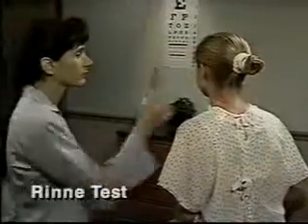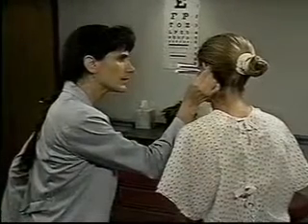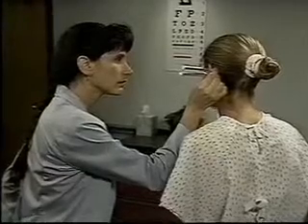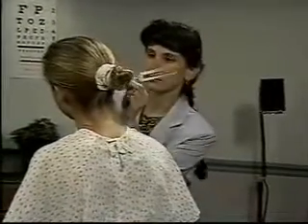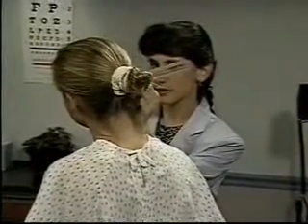To do the Rinne test, place a lightly vibrating tuning fork on the mastoid bone behind the ear. When the patient indicates that the sound is no longer heard, quickly place the vibrating fork close to the ear canal. Normally, the patient can hear vibration longer through air than through bone. Can you hear this? Repeat the test on the other ear. Tell me when it stops.